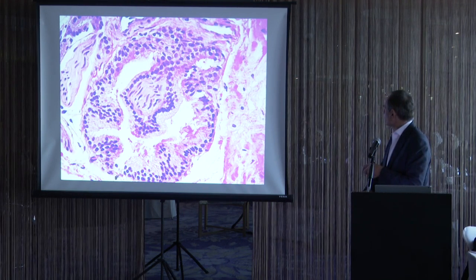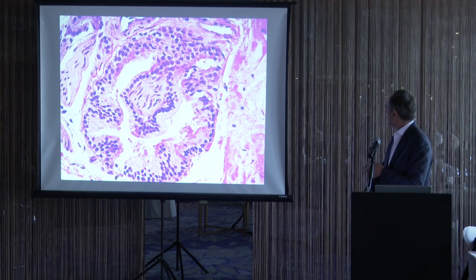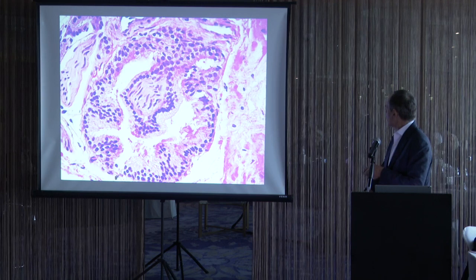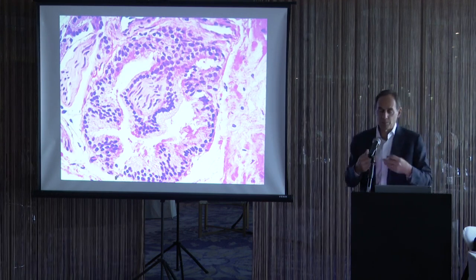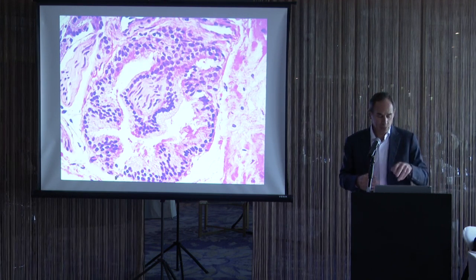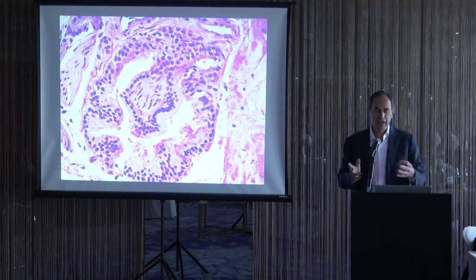Only cancer circumferentially, 180 degrees, 360 degrees, wraps around a nerve like this. We'll talk about some mimickers that can partially go around a nerve, but when you see a gland going entirely around the nerve, again, that's cancer.